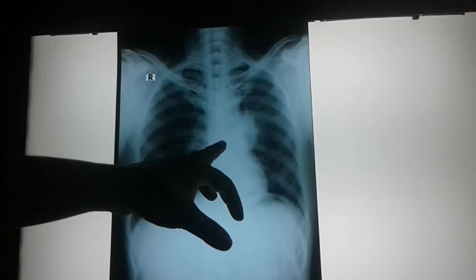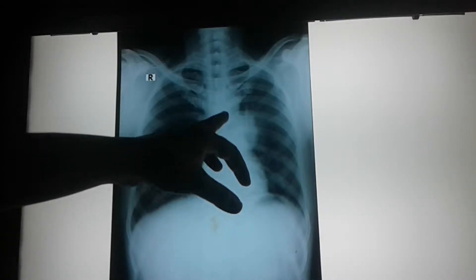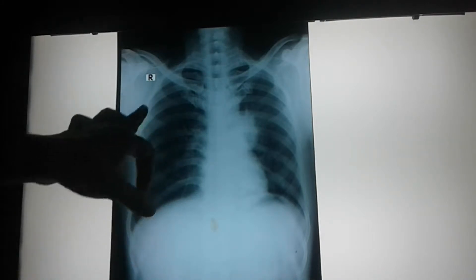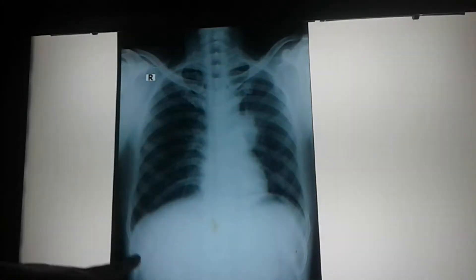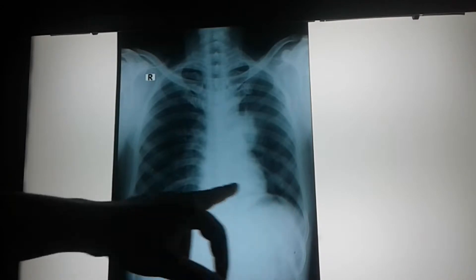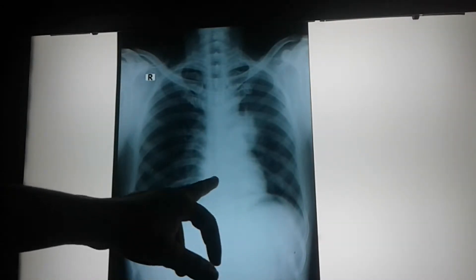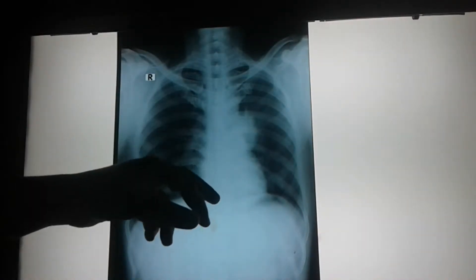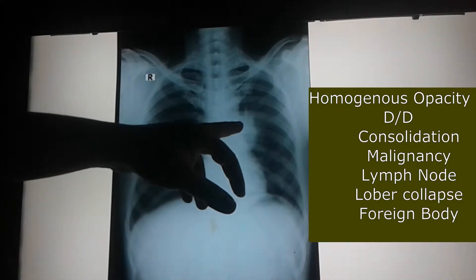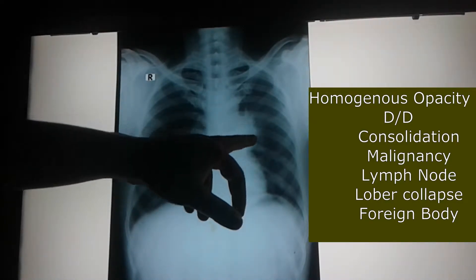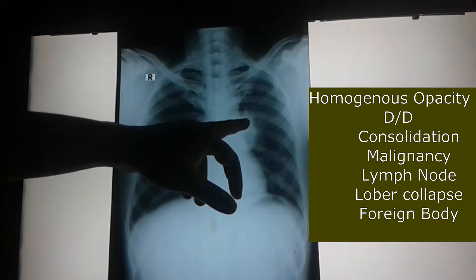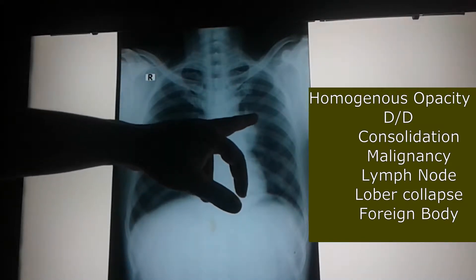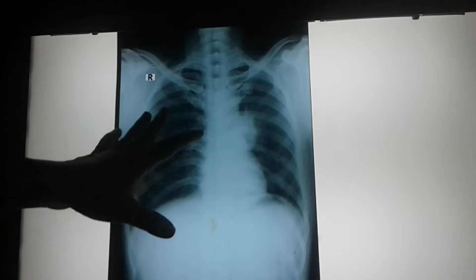The mediastinum is central in position with normal cardiac silhouette. Both lung fields appear normal. The costophrenic and cardiophrenic angles also appear normal. However, there is a homogeneous opacity involving the left hilar region, and there is no obvious bony abnormality.